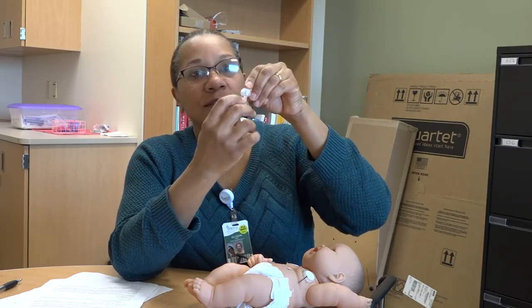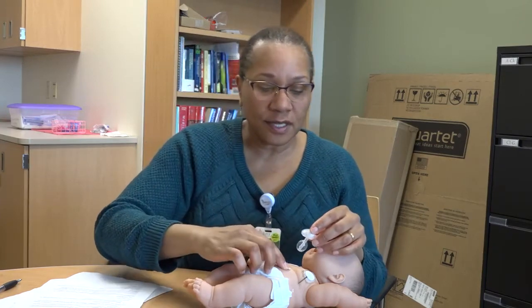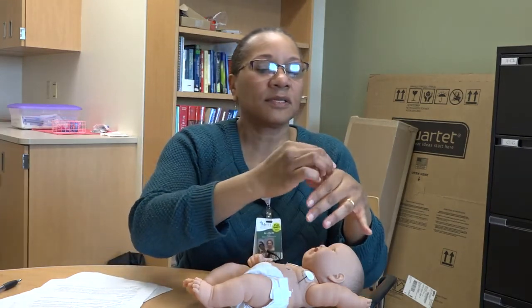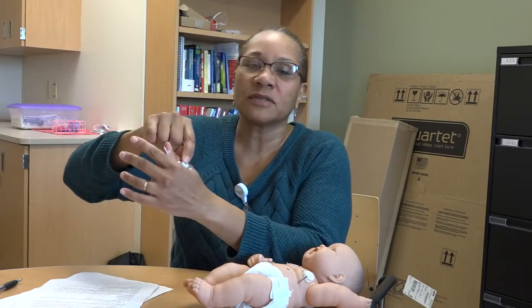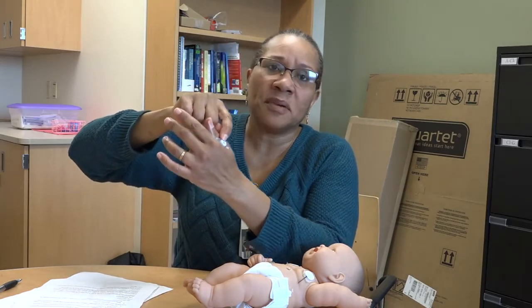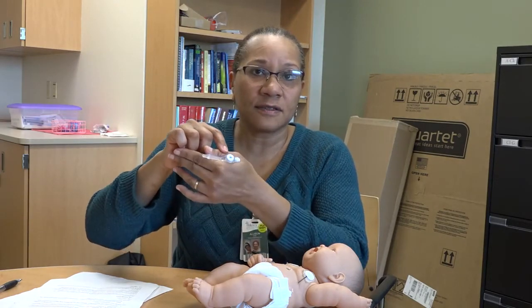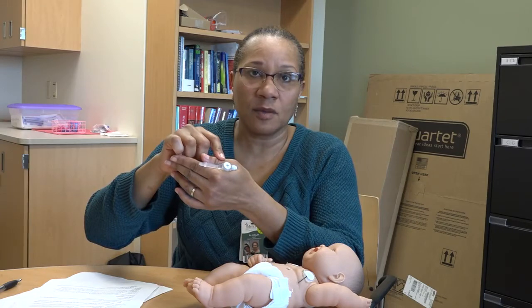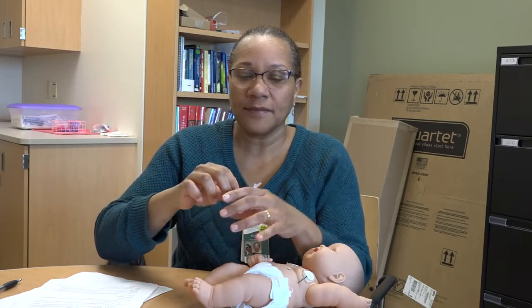And as long as you can see a little bit of that white line and you're not noticing that the skin is building up around the balloon, so it kind of looks like this, almost like the G-tube is buried into the skin, that most definitely is a fit that is too tight and not appropriate, and setting ourselves up for some skin breakdown there, okay?